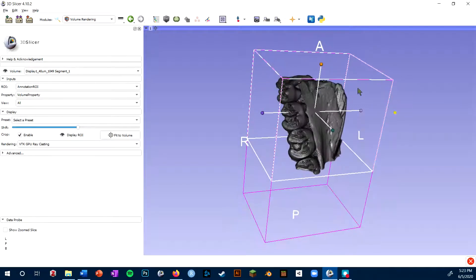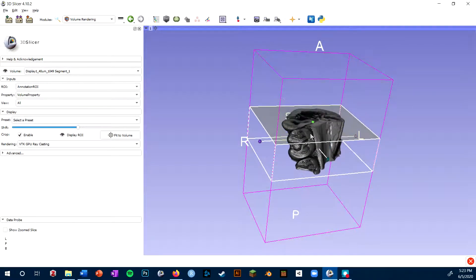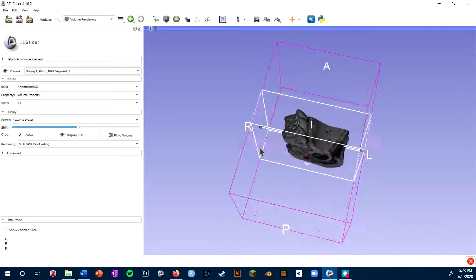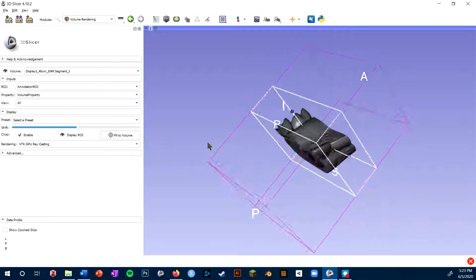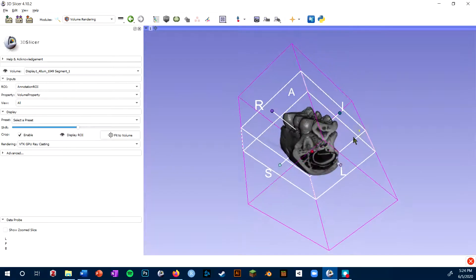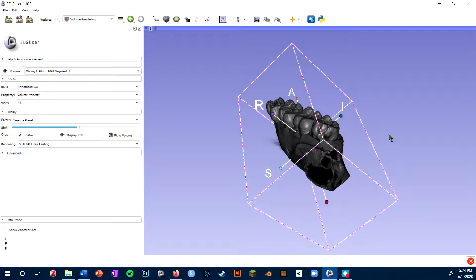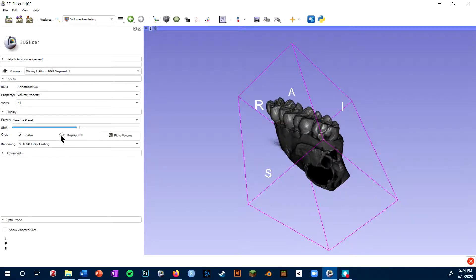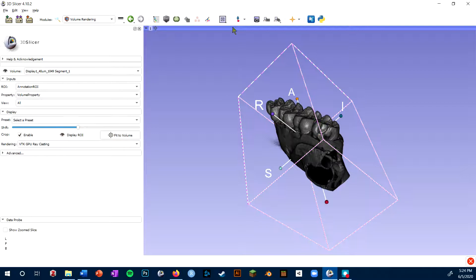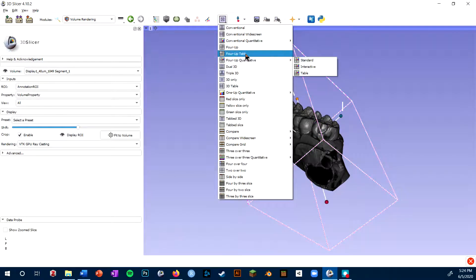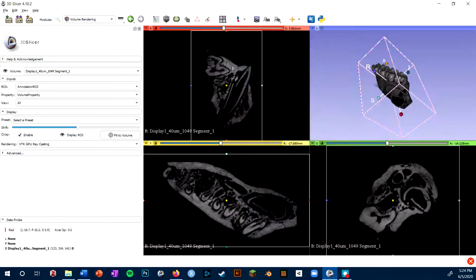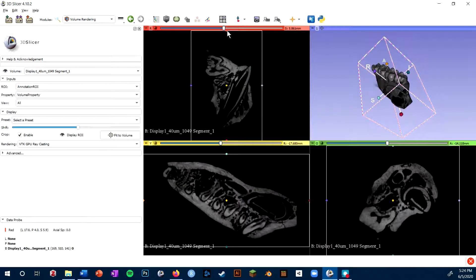So for instance, I might want to crop to just this tooth. You can click fit to volume to reset that. You will also be able to adjust the ROI in the slice view, which can be useful if that's an easier way to see your specific anatomy.